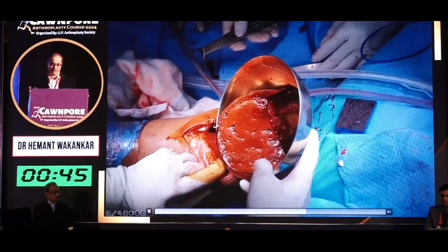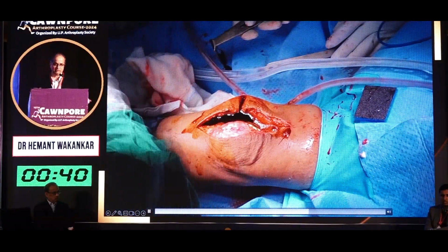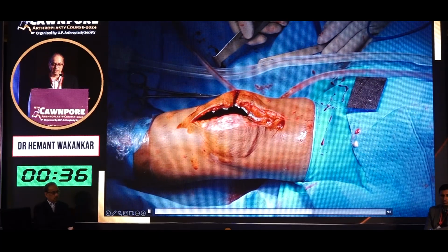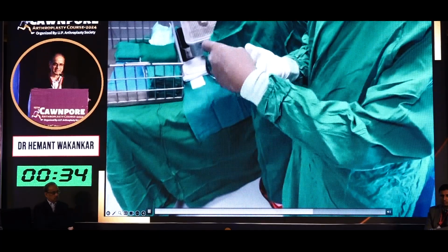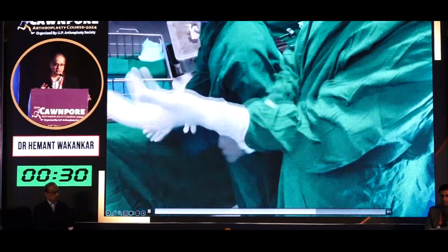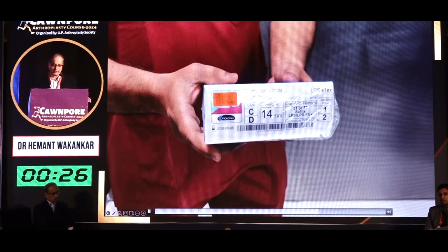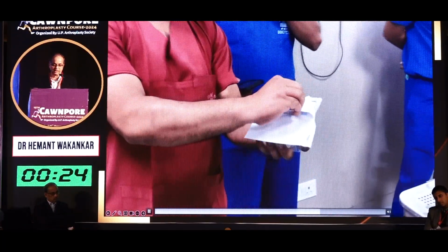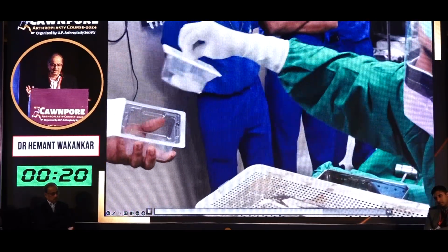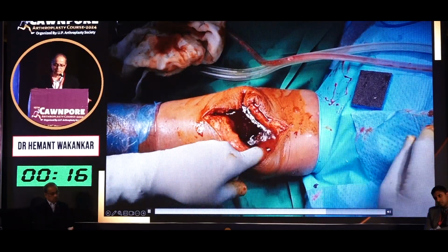Now then I'll flood the knee with 5% betadine. This is a 10% solution that is there. I have diluted it by 50%, so it becomes 5%. So I flood this knee with 5% betadine solution at this stage, and keep that fluid in by the clock for 5 minutes. Keep it inside, don't do anything until this is really a contact time of 5 minutes with the betadine solution. Maybe put new drapes on, everybody changes gloves, and get a new poly in. So get that betadine in for 5 minutes.